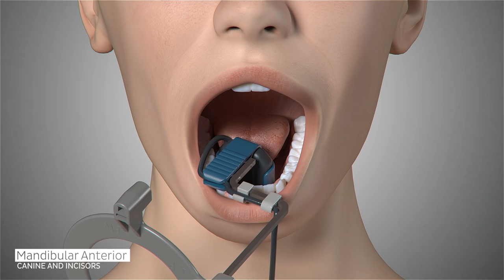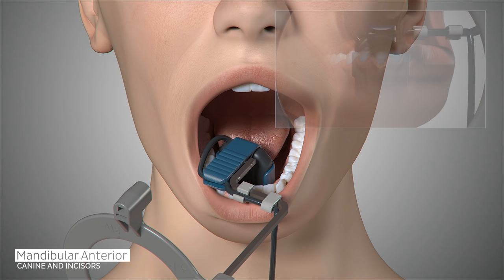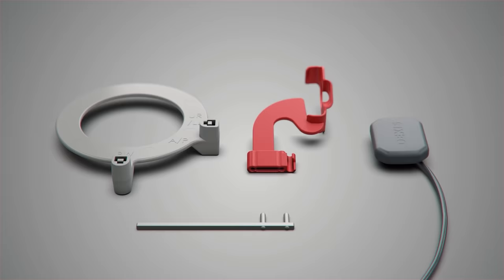Ask the patient to open in order to reposition the sensor to the right canine. Position the sensor so the canine is centered on the sensor and the sensor is parallel to the long axis of the tooth as much as possible. The tongue should be mildly displaced so the sensor can be inserted into the floor of the mouth and far enough away from the teeth as not to impinge on the mandibular curve. Ask the patient to gently close and slide the aiming ring as close to the patient's chin as possible. The cone of the x-ray emitter must be placed flush with the aiming ring and then trigger your exposure.